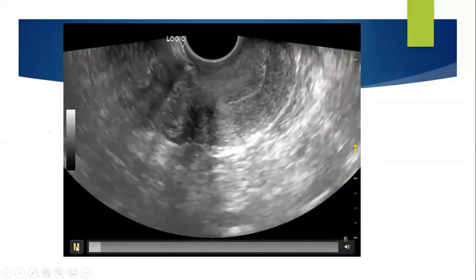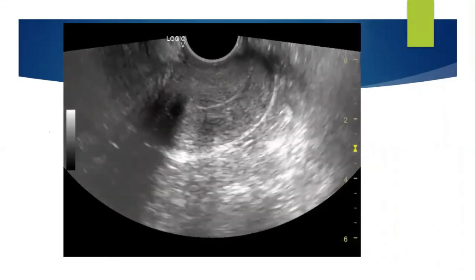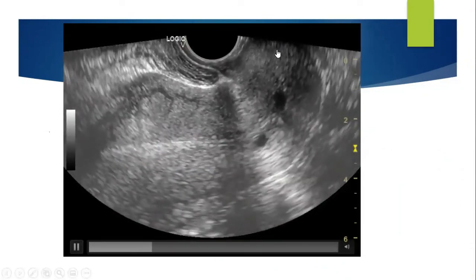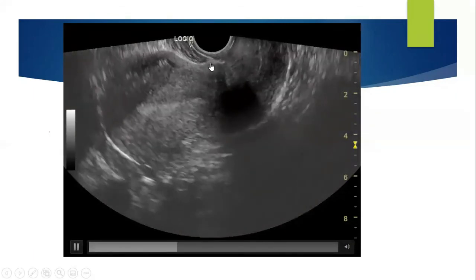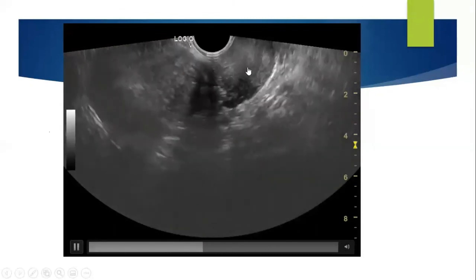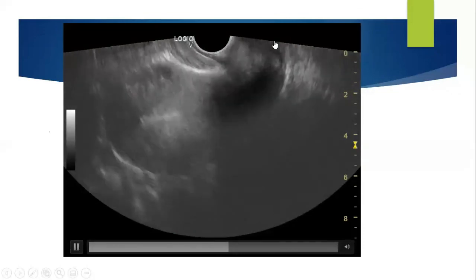And this zoom picture, which is my last video, which I want to show you how the cervical lip will be seen here. And you all can, I think, see the Nabothian follicles. Can you see this fold? So this picture, I want to tell you that if you draw a line from here to here, you will reach internal os, and how an external os is seen here.